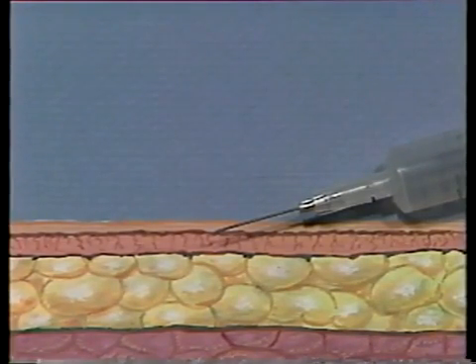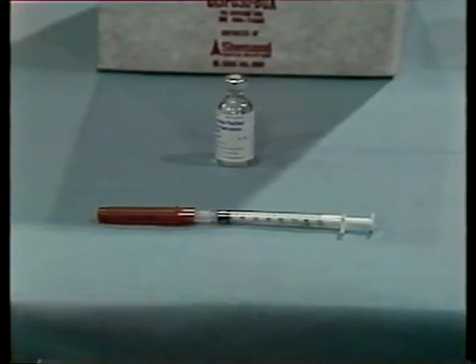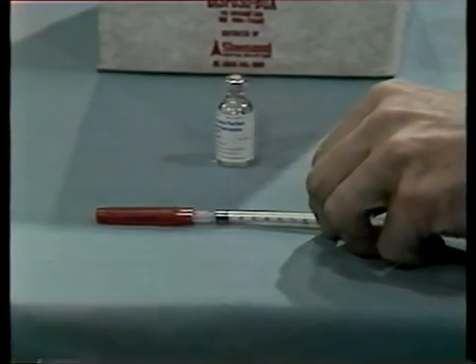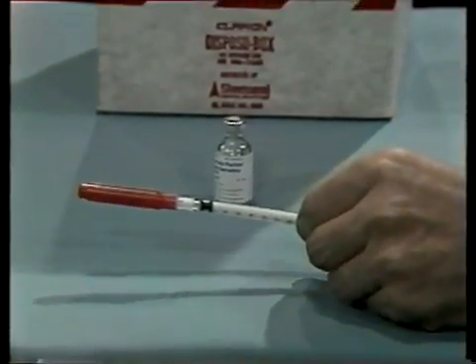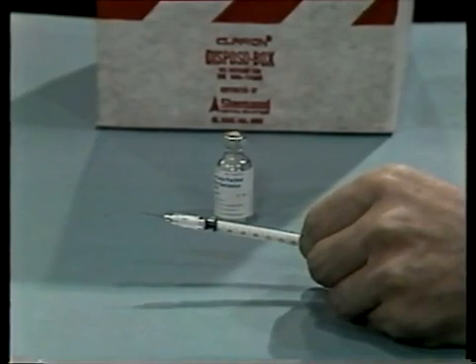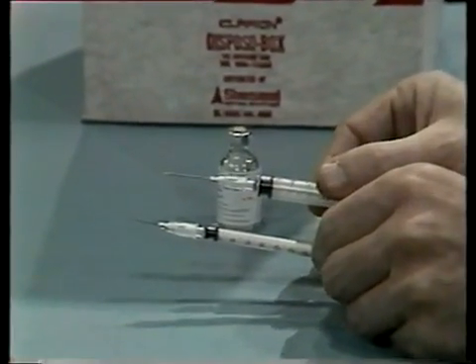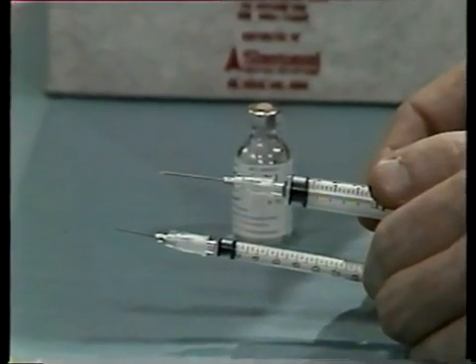Since very small quantities of solution are administered, you use a much smaller syringe than you would use for other kinds of injections, and you would use a smaller needle too. Here you can see the difference between the kind of syringe which might be used for an intramuscular injection and the smaller needle and syringe for intradermal injections.